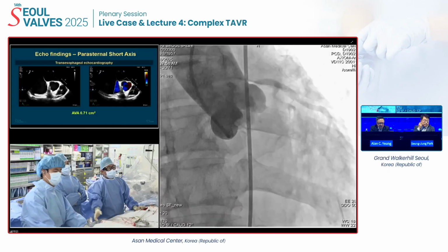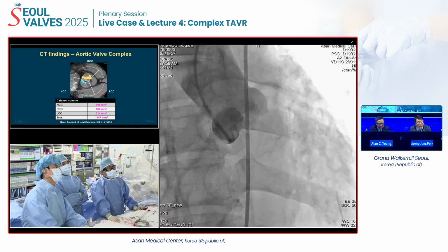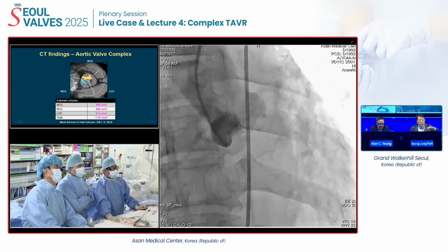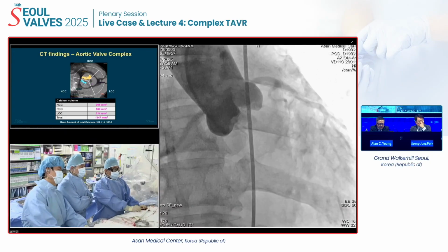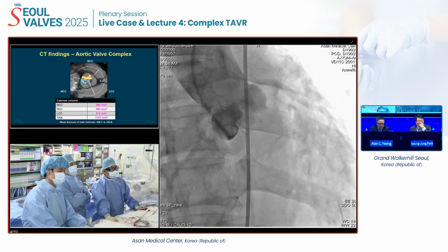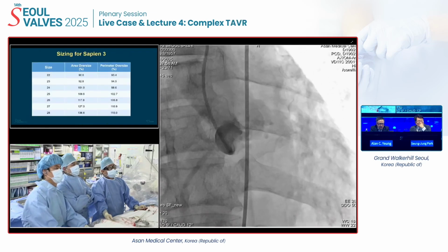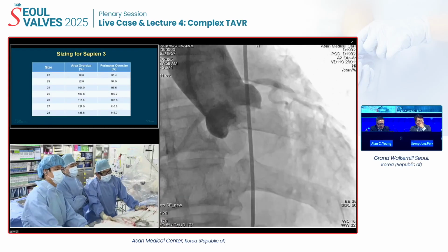Yeah, so typically when there is this raphe that's fused, and if it is pretty calcified, that obviously has some risk of poking it out of the annulus. So usually that corner we'd like to pre-dilate as well to make sure that the valve can go around that corner, which is the outer border of the arch. So those are the two things, and I would probably be more on the undersizing a little bit, just to make sure it's safe, and you can always post-dilate another CC or something like that, because annular rupture is no fun. So do you obviously like to select the 23, not 26? Not 26. Yeah.